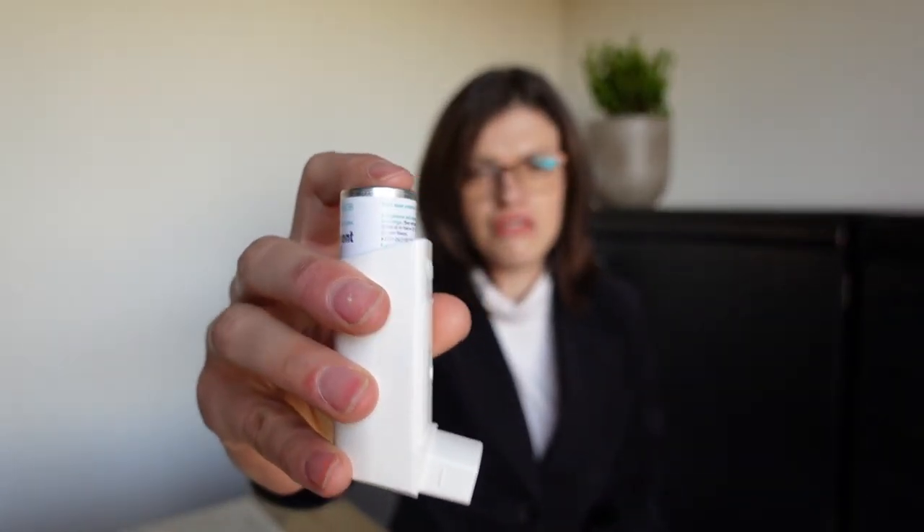The teeth will come around this area — you don't have to necessarily bite, just rest the teeth here and the mouth will cover the remaining openings. The patient has to breathe out thoroughly before putting this into the mouth, and then as he presses down on the aerosol, breathes in slowly.